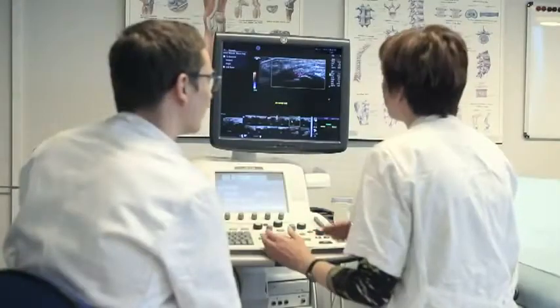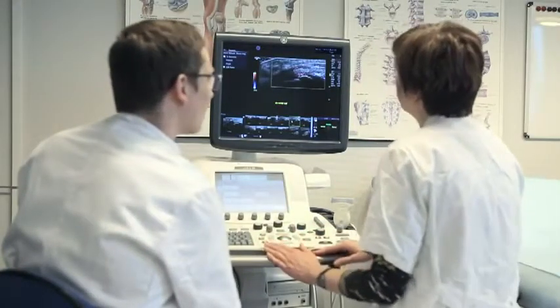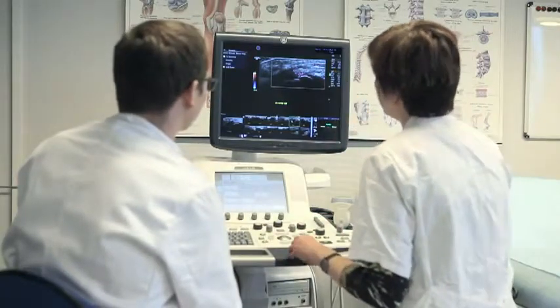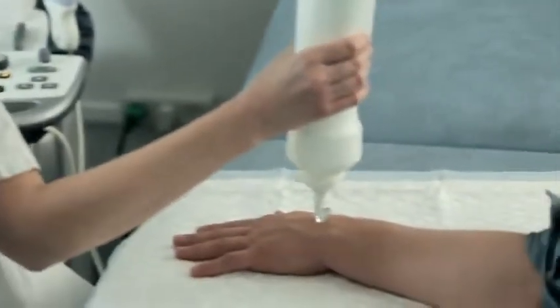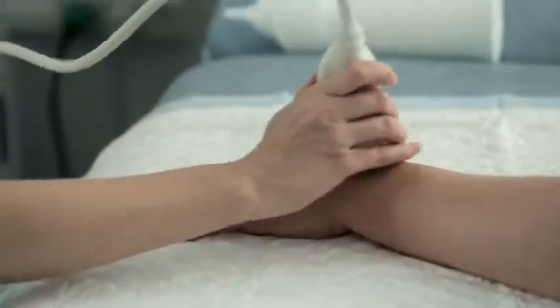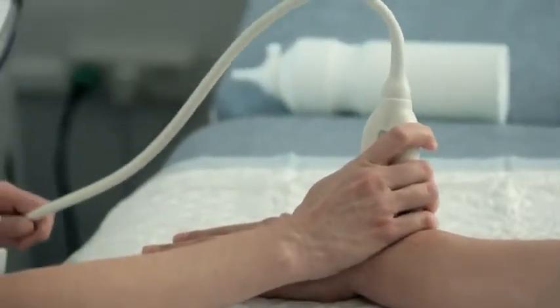I would like to use ultrasound as a standardized examination for follow-up in all our patients when they start their DMARD or biological treatment. In those cases, I start with a baseline examination by using ultrasound to evaluate a predefined set of joints. I evaluate them for signs of B mode changes and for Doppler activity. Then they come for regular follow-up sessions during their treatment, and I evaluate whether the Doppler activity and synovial hypertrophy actually diminish while the patients are being treated.